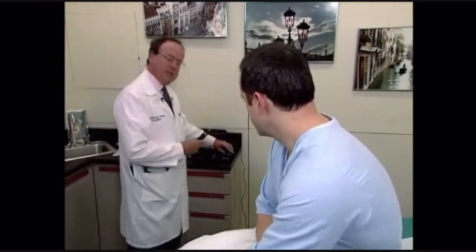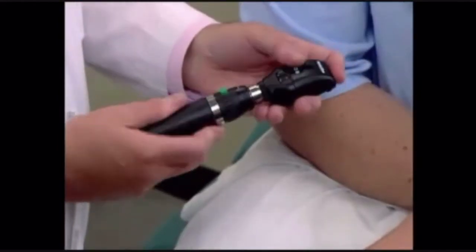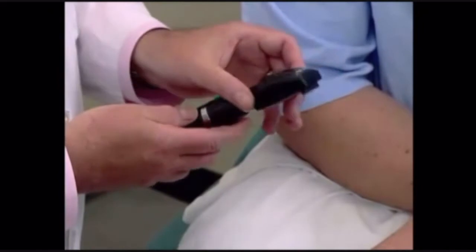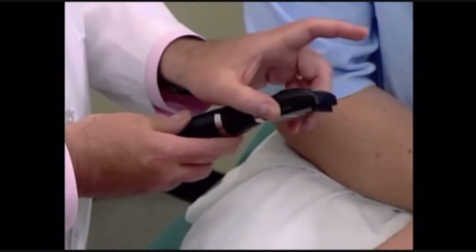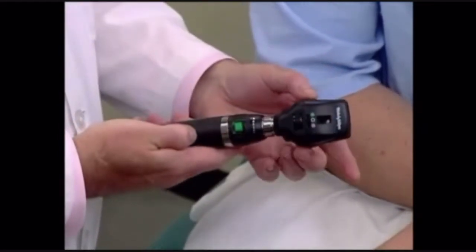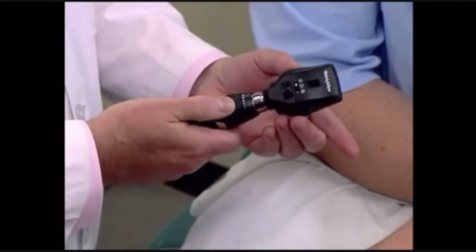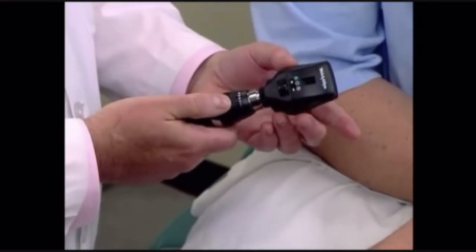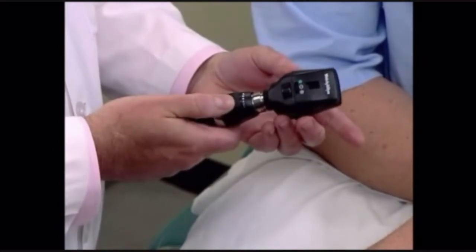The first is the standard direct ophthalmoscope. A direct ophthalmoscope is an instrument which has a series of lenses which takes into account your refractive error as well as the refractive error of the patient. It's a light source which allows visualization of the cornea, the lens, the vitreous, and the retina.